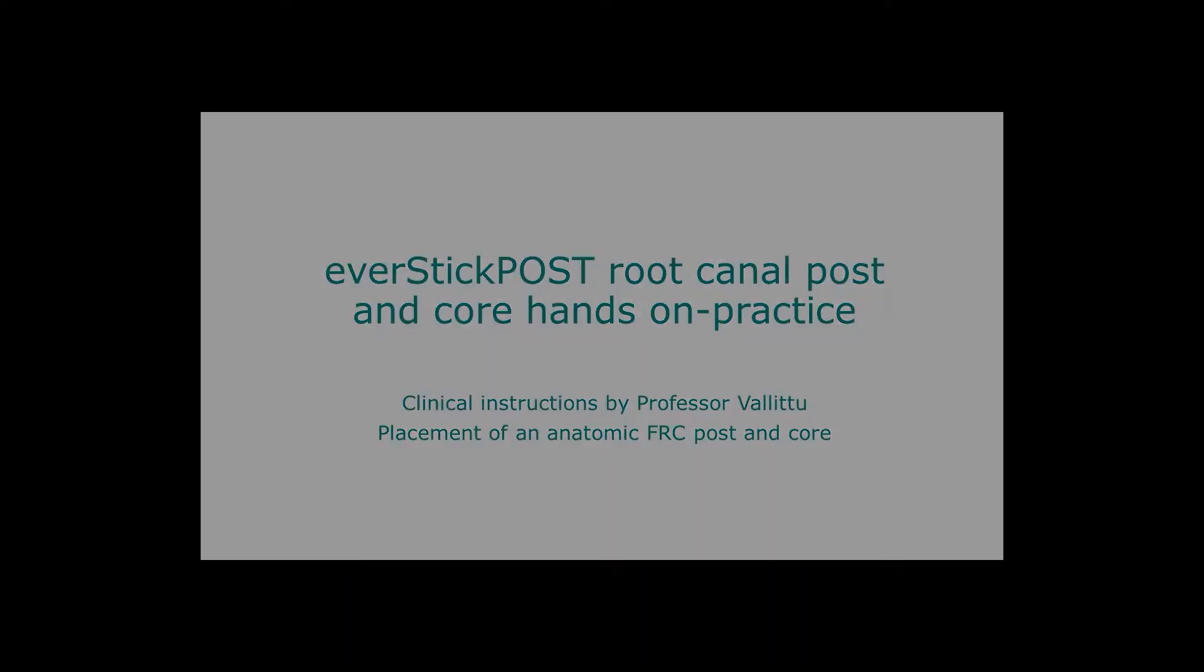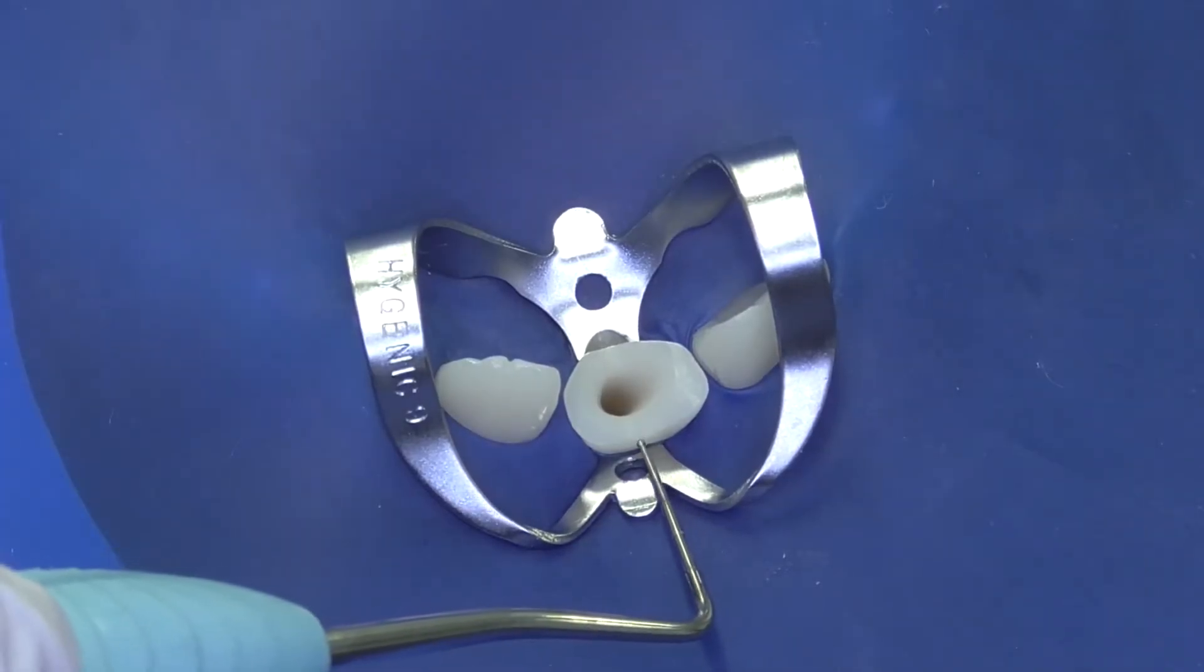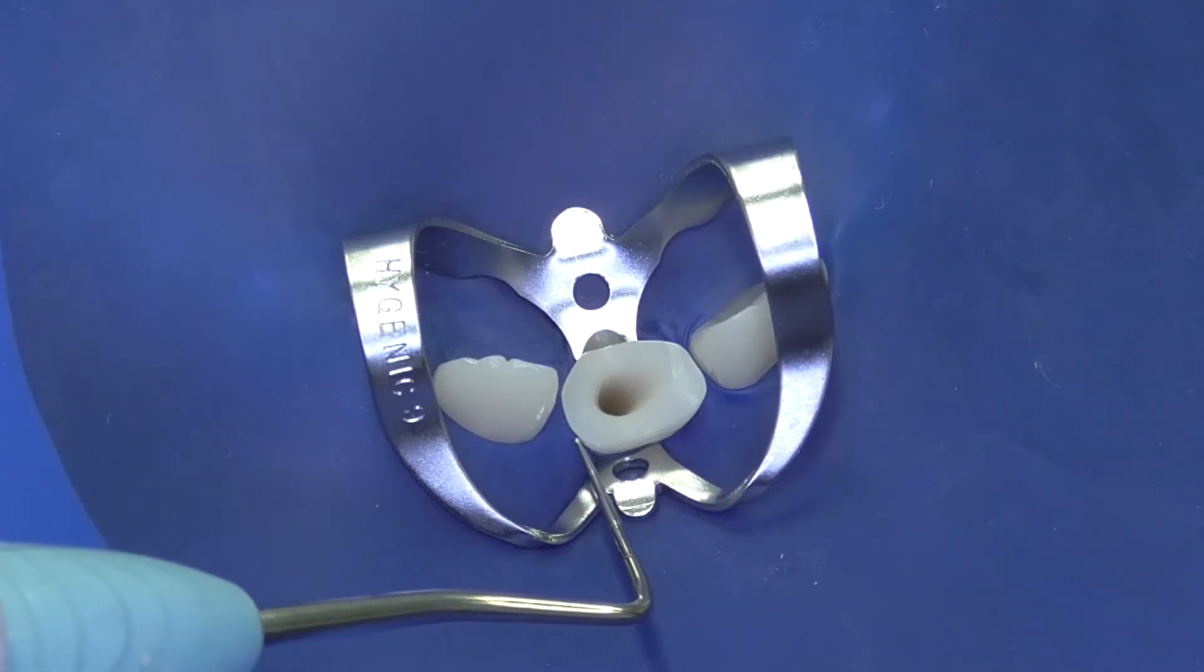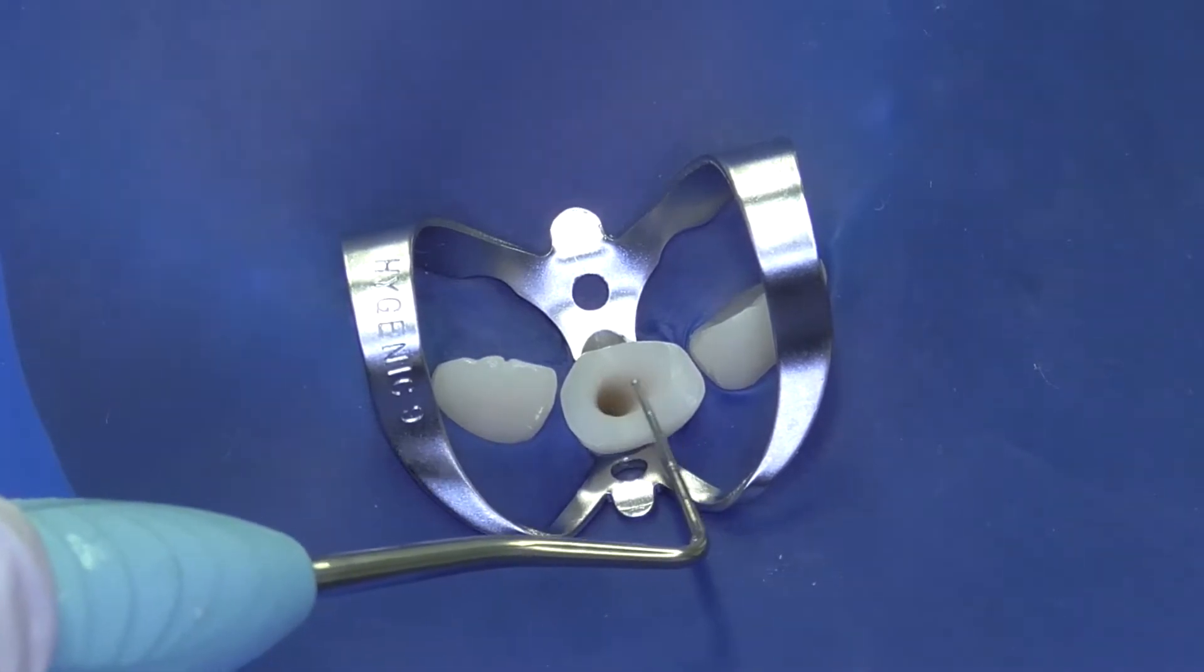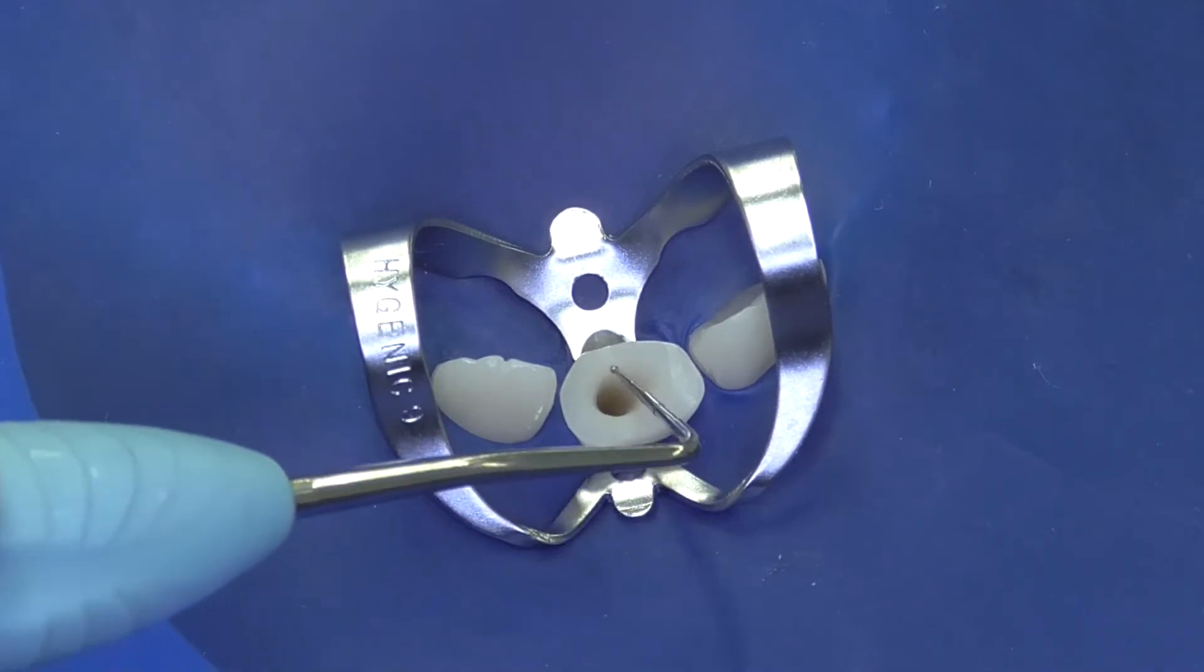In this video demonstration, we are preparing a custom-made individual fiber post in the case where we do not have a chance to make a metal ferrule of a metal-ceramic crown. Instead of a ferrule, we are using the space we have in the coronal opening of the root canal, which will be fully filled with fibers.